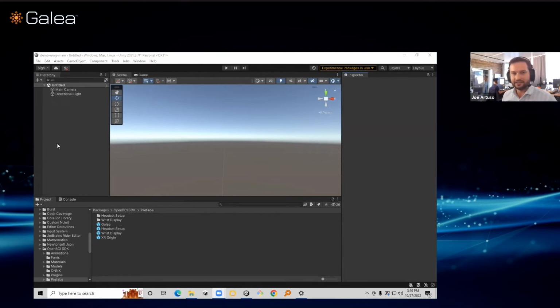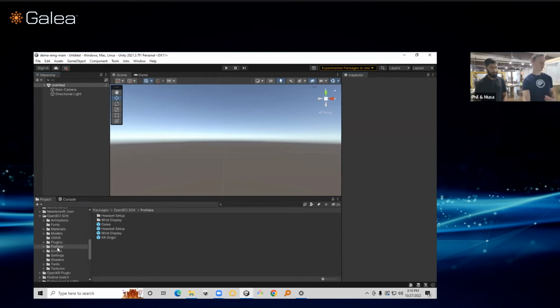Cool. So carry on with some of the Unity and improved connectivity and GUI stuff that we wanted to cover as well. Absolutely. The first thing I'd like to talk about is how we've improved the ability to connect the headset, from turning it on and getting it connected and streaming data into your computer. We've listened to a lot of feedback from our early partners, and they've told us it's a little difficult and complicated to connect in the old method that we were using.